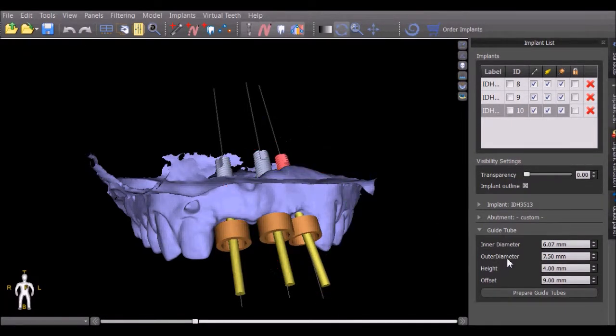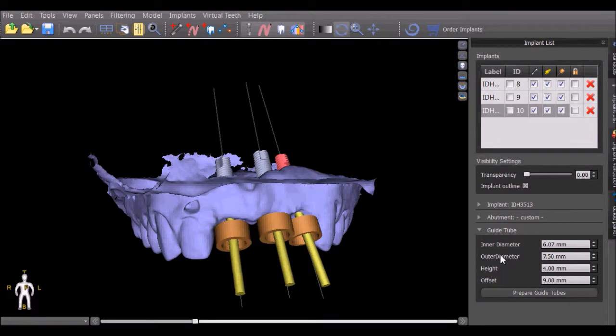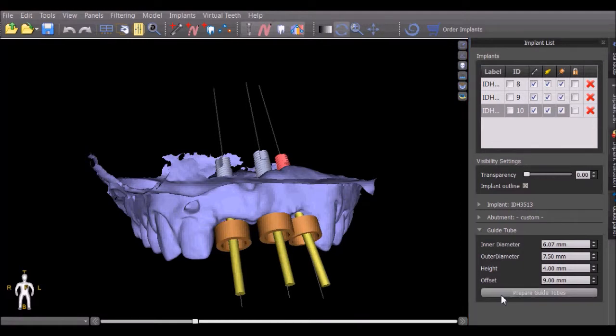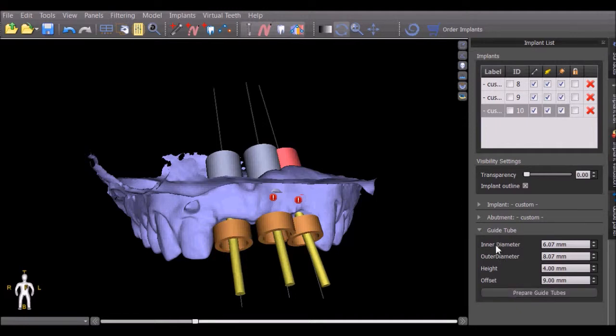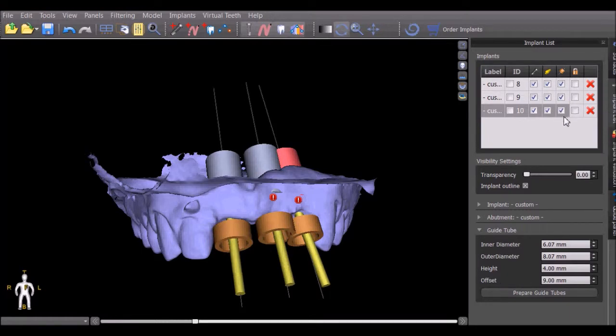The outer diameter of the guide tube should be set to be 2 mm larger than the inner diameter. This value can be set automatically by pressing the Prepare Guide Tubes button. The Prepare Guide Tubes button also copies the settings that were done for this guide tube to all the other guide tubes that have a check on the implant list.